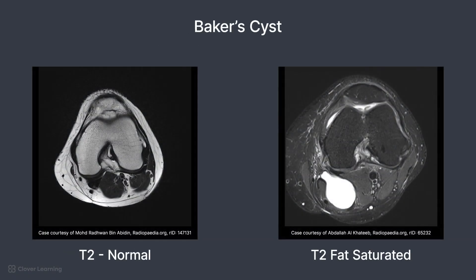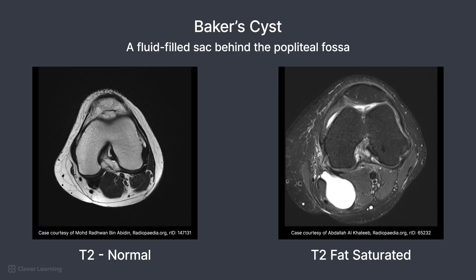A Baker cyst, also known as a popliteal cyst, is a fluid-filled sac that forms in the popliteal fossa, the area behind the knee joint. The cyst develops due to an accumulation of synovial fluid, often as a result of an underlying knee joint condition that causes excess fluid production or leakage. On MRI, they appear as a well-defined high-signal fluid-filled sac in the popliteal fossa on T2-weighted images. These are often used with a fat-saturation imaging option. Contrast media is typically not needed for this pathology.